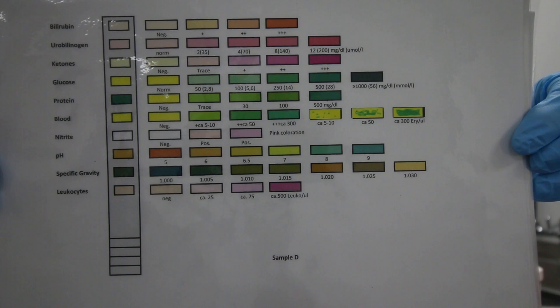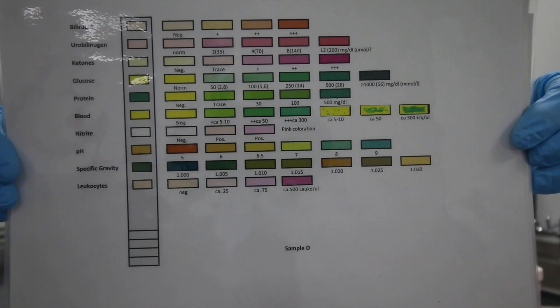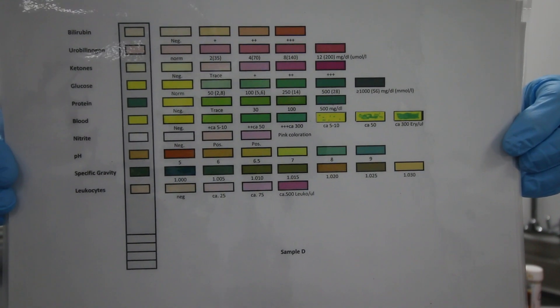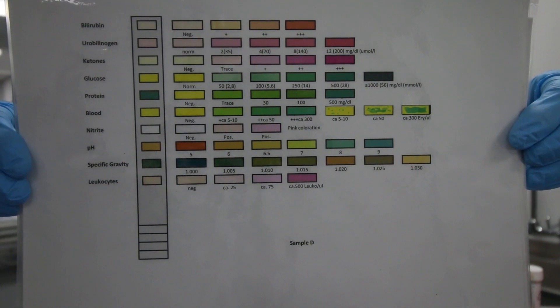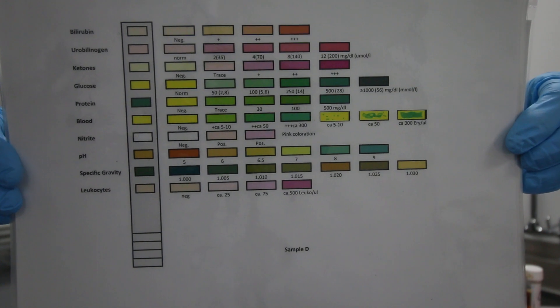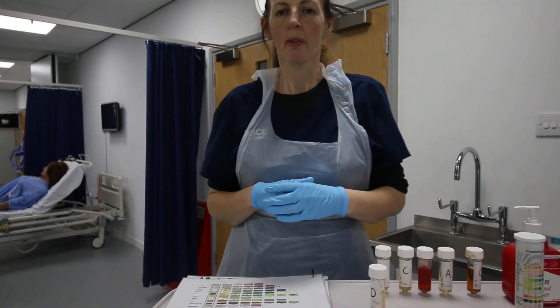I'm going to write down all the parameters — on the side you've got leukocytes, protein, bilirubin, and so on — and I'll record that protein has been detected. The indication for protein being detected is usually renal disease, sometimes diabetes or high blood pressure, where protein is leaking from the kidneys into the urine.